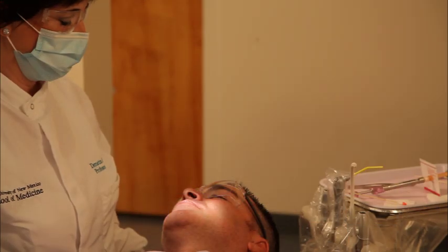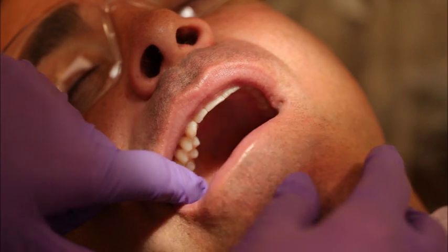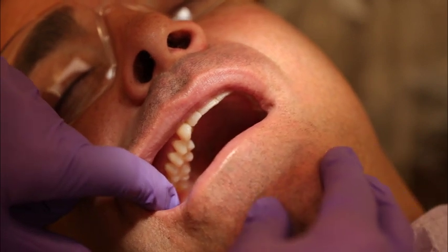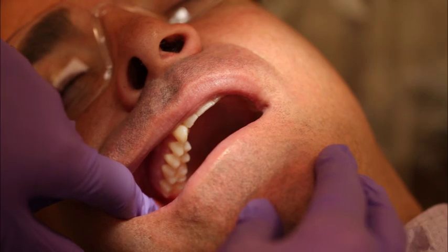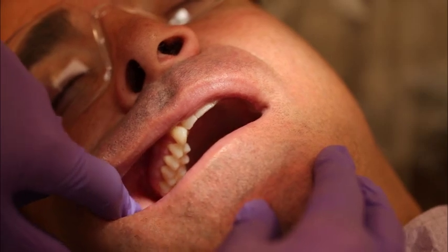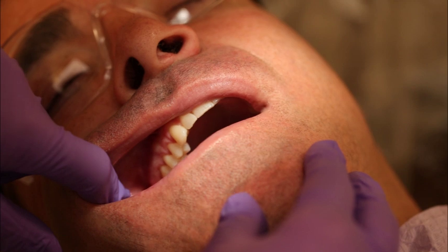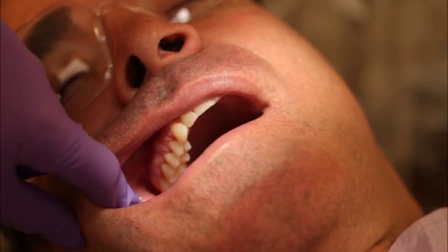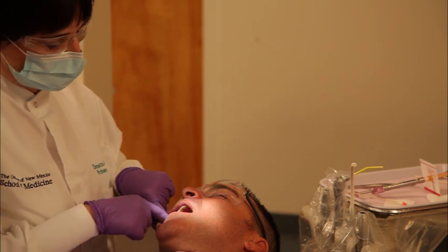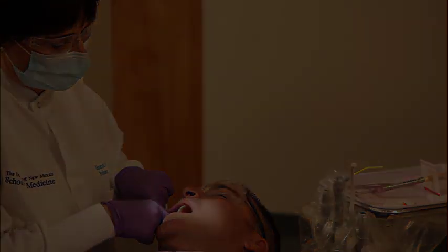Ask the supine patient to partially open his mouth and slide the mandible toward the injection side, opening the area for greater visibility. Retract the cheek vertically and not horizontally, pulling the tissue taut by using the index finger for intraoral retraction and the thumb for extraoral retraction on the dominant side for visibility and to help with the fulcrum. Palpate the injection site to ensure that only soft tissue is injected.